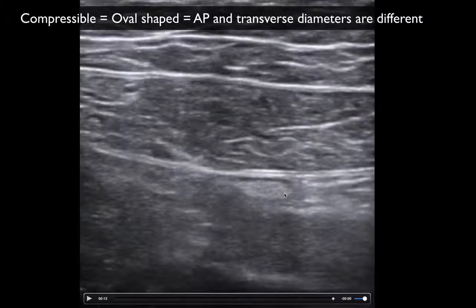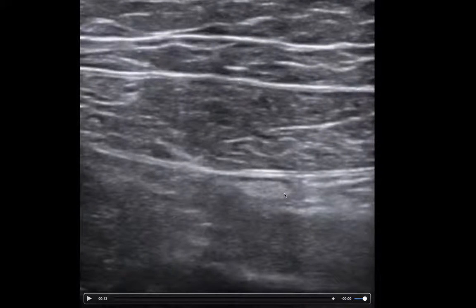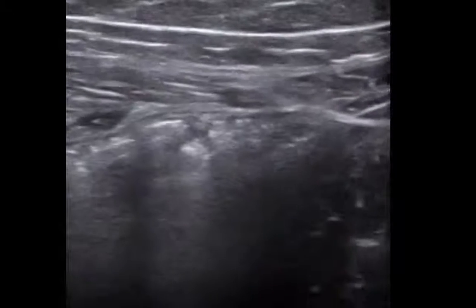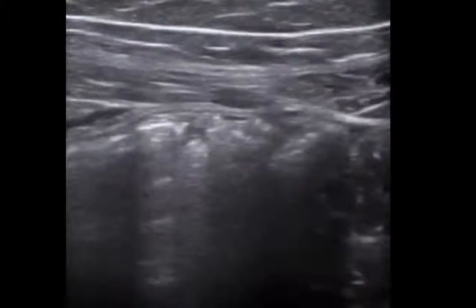But if you have a patient that has appendicitis, measuring it anterior, posterior, or lateral doesn't really matter as much because it's going to be a nice circular structure. Now, if you've done all of your tricks and you still can't find a normal or abnormal appendix, then you're going to have to go and look for it.